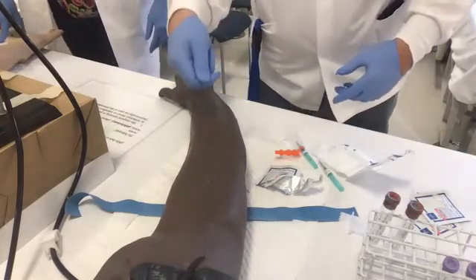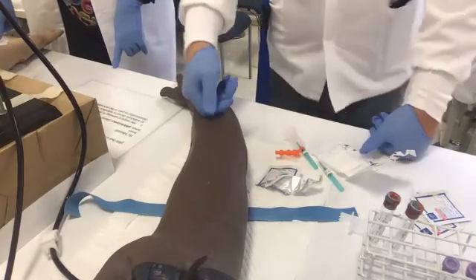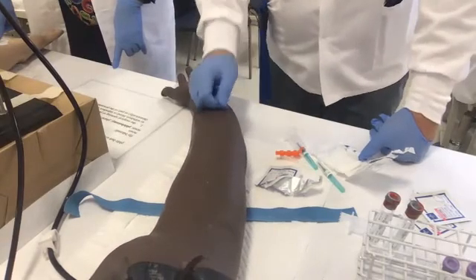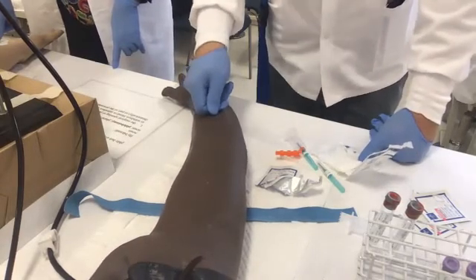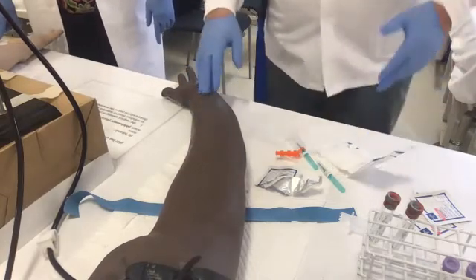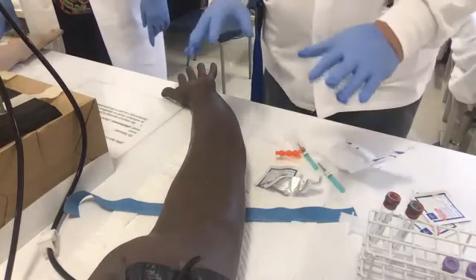And this thing is an anchor. What does an anchor do? I anchor like this, and then you put your hand like this. So if this guy moves, then I can not only feel it, I can also prevent it, like, hey, Mr. Brown, oh, right? And then you're like, oh, okay, sorry. Because the patient could be anxious and they just want the procedure over.